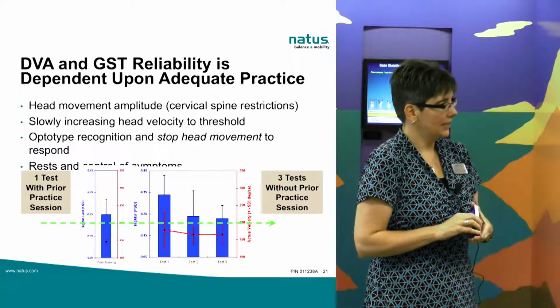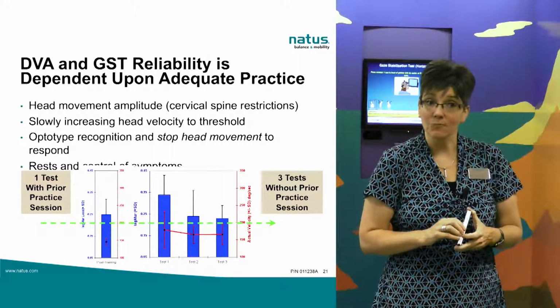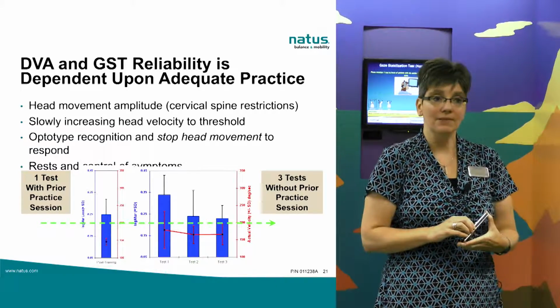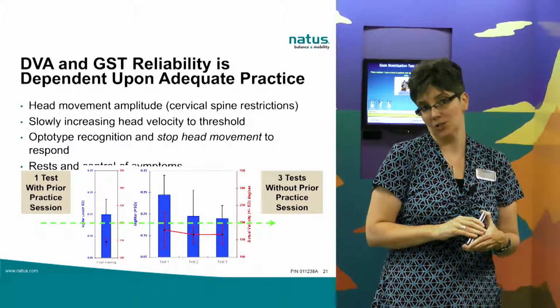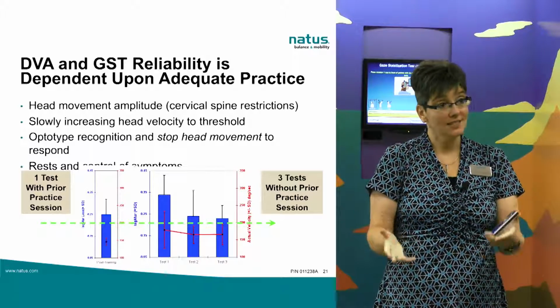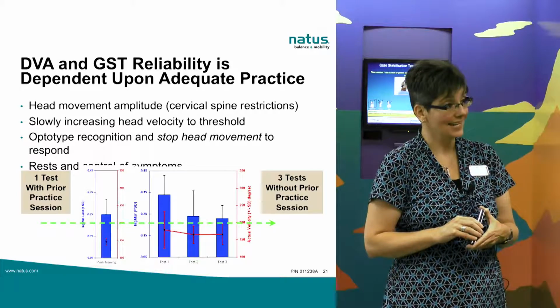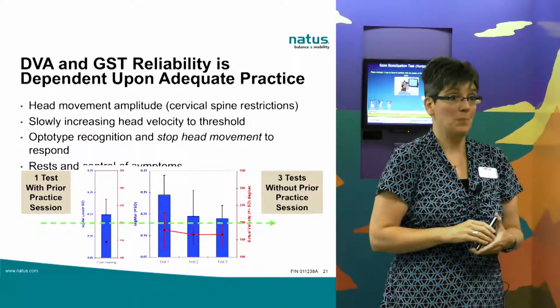This was some of the validation study that was done looking at practice and the importance of practice. One of the most common calls I get from people in the field is, I feel like my data is inconsistent. And my first question is, did you practice and did the patient practice? Because you can see these tests are not easy to administer. These are our most complex tests, and it takes a lot of practice, especially on the part of the operator.